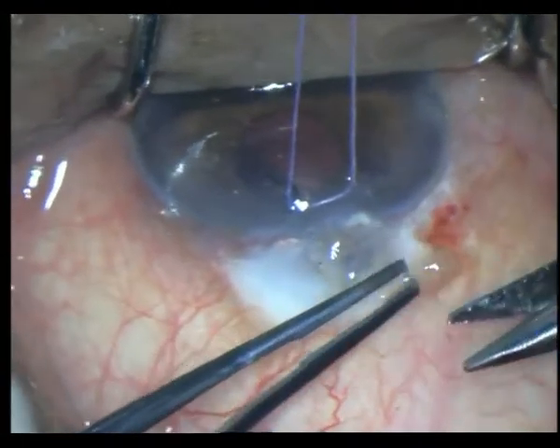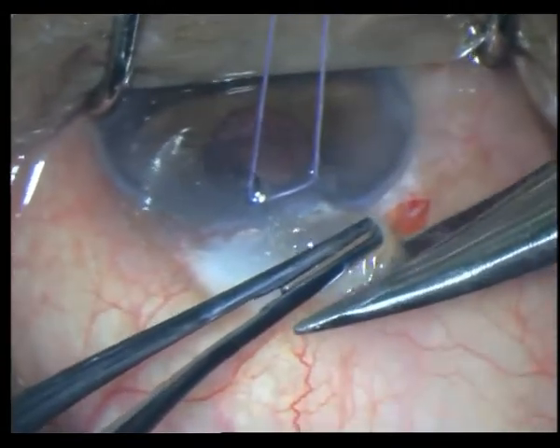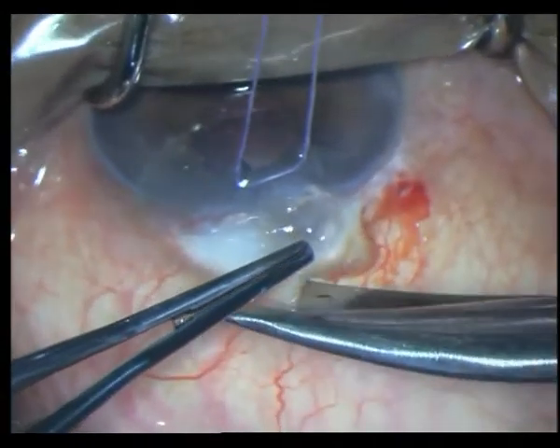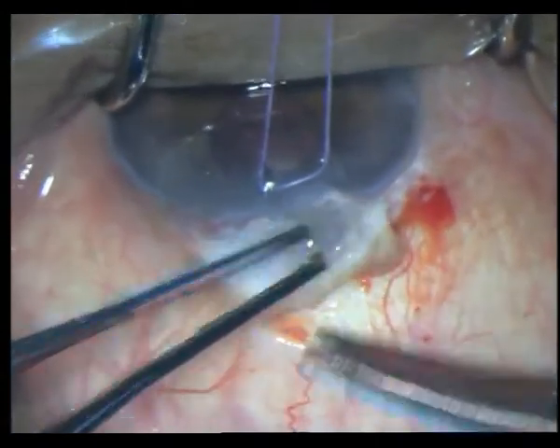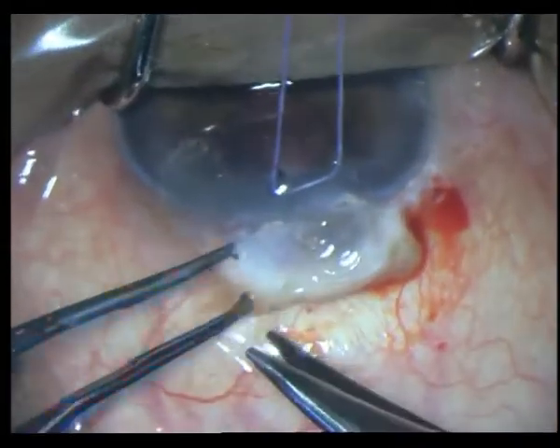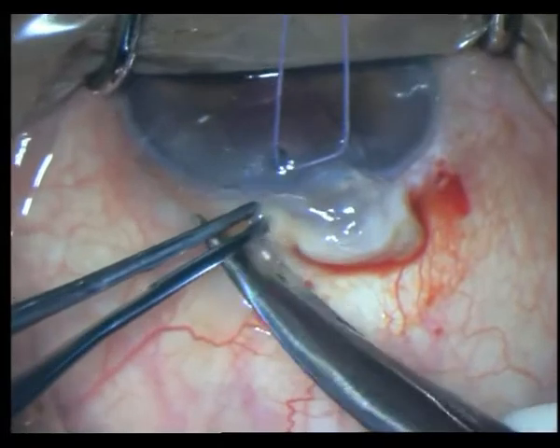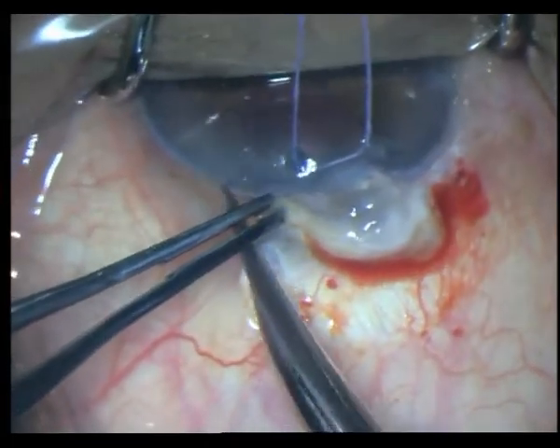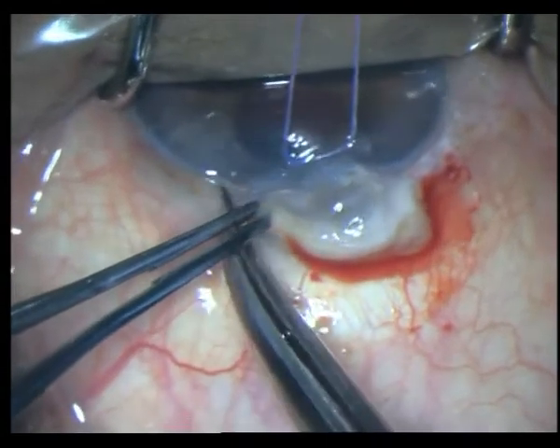We planned to excise this bleb and put a scleral patch graft over the same. Here is how I went about the surgery: after placing a corneal stay suture with 6-0 Vicryl and just excising around that almost necrotic bleb.